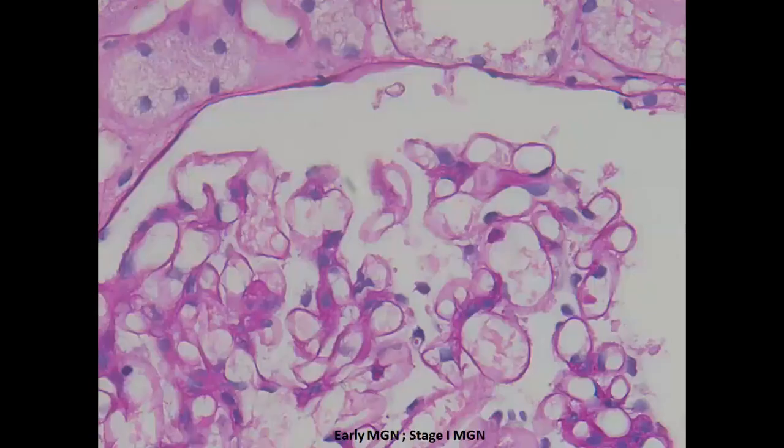An early stage membranous will have a normal glomerular morphology. Whenever we say that a glomerulus is showing thickening of the glomerular capillary wall or capillary loop... Here you can see these are the capillary loops with empty lumen, and this is the mesangium. The mesangium is showing only a single nucleus, which means there is no mesangial hypercellularity. When we label anything as mesangial hypercellularity, there has to be 4 or more nuclei in the mesangium. This is the Bowman's capsule.